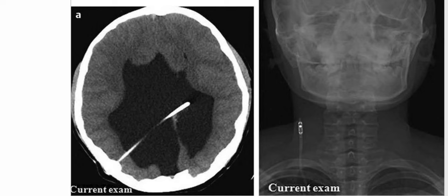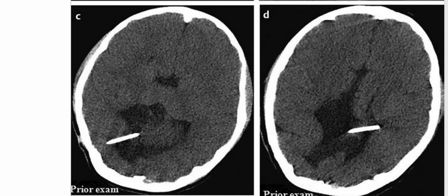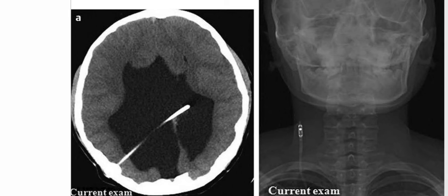So these are images of a 12-year-old boy presenting with altered mental status and a history of Chiari 2 malformation with ventriculoperitoneal shunting. On the unenhanced axial CT scan, you can see that there is significant ventricular enlargement compared with the baseline examination. These are the prior examination images, and compared to these images, there is significant ventricular enlargement in the current scan.